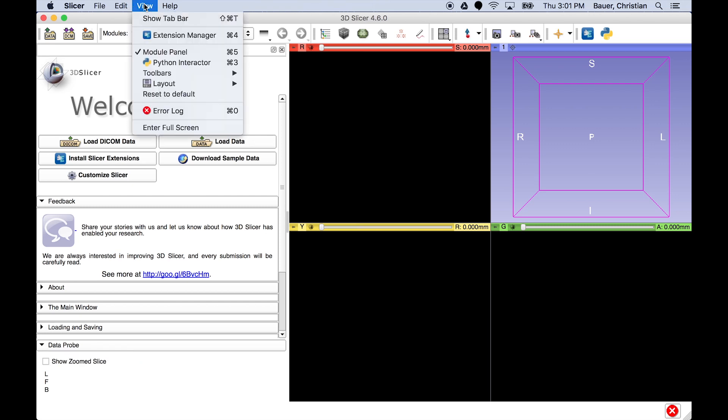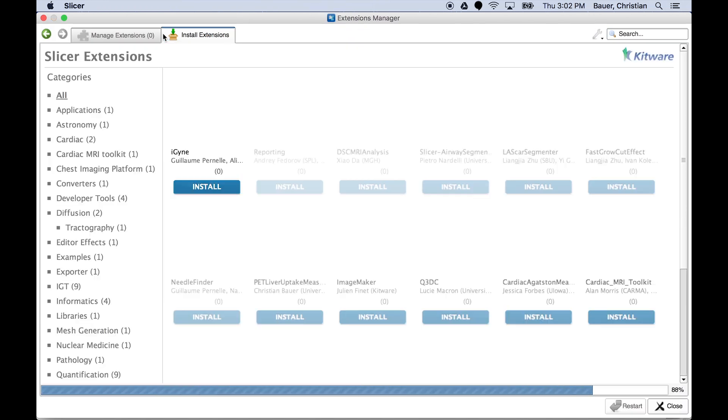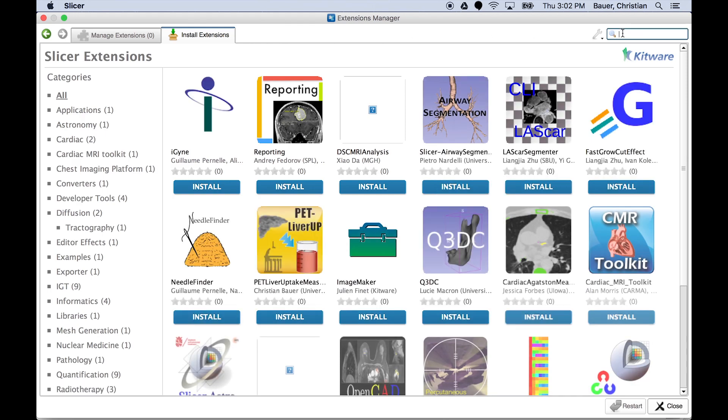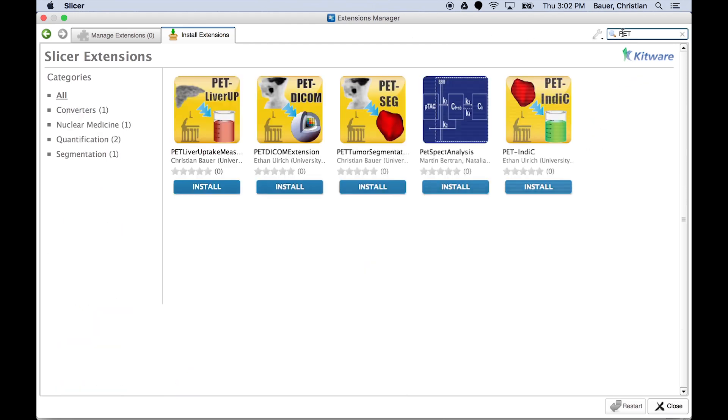From the 3DSlicer main window, navigate to the Extension Manager, then search for the suite of PET tools. Select the PET-DICOM extension for installation and restart 3DSlicer.